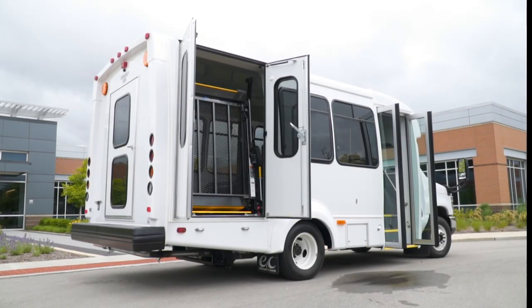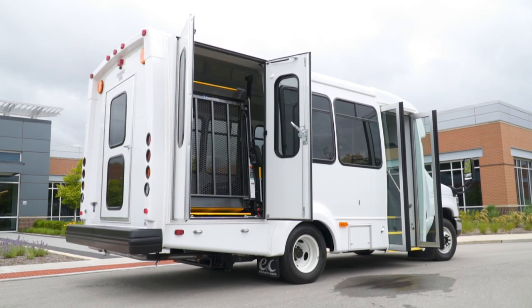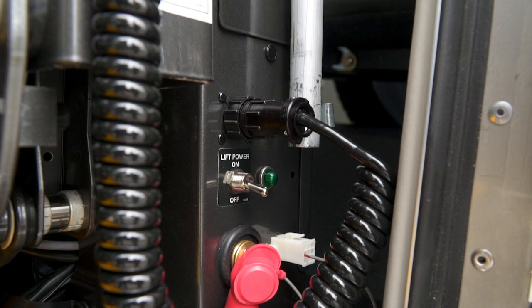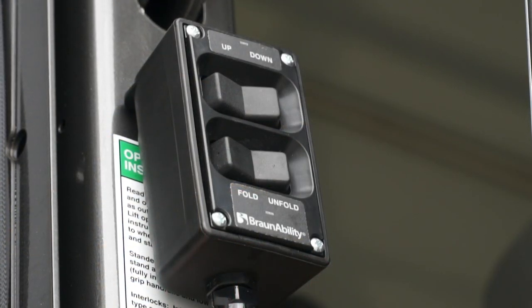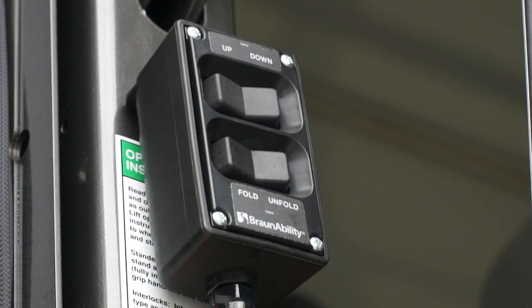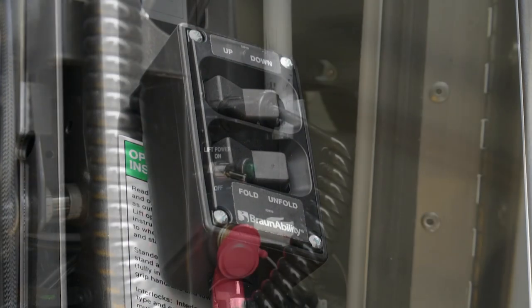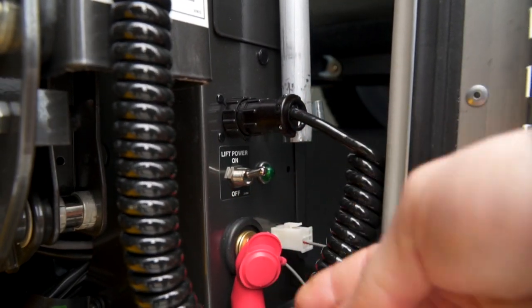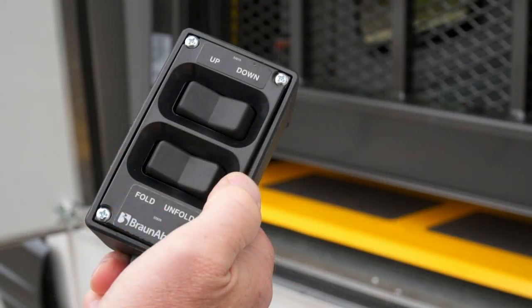All of the key functions of your BraunAbility lift are easily and conveniently controlled using the on-off control switch mounted on the outboard face of the pump module and the up, down, fold, and unfold control switches on the BraunAbility handheld pendant control. To operate the lift, check to be sure the on-off switch is in the on position and then simply use the handheld pendant to choose the appropriate functions.